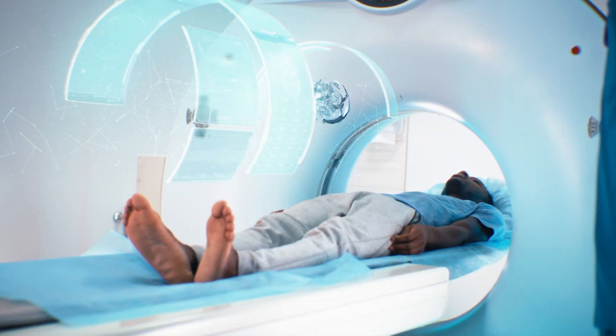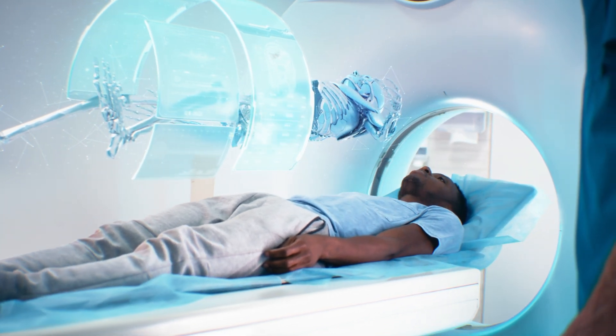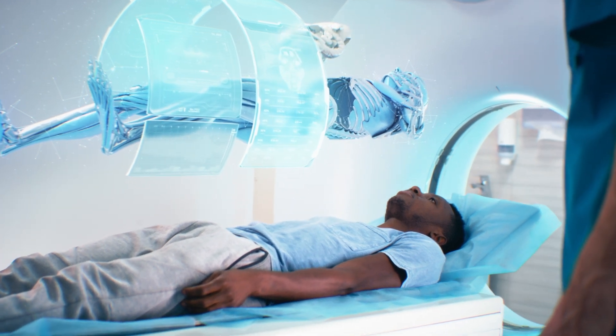Before the surgery we would have reviewed your pre-operative x-rays together. Once we have booked the surgery, we organize a three-dimensional scan to look at the full morphology or shape of your hip and the surrounding structures. It gives us all of the dimensions of the acetabulum — the socket — the femoral head — the ball — and the shape, twist, and changes in the anatomy of the proximal femur, or the top of your hip bone.